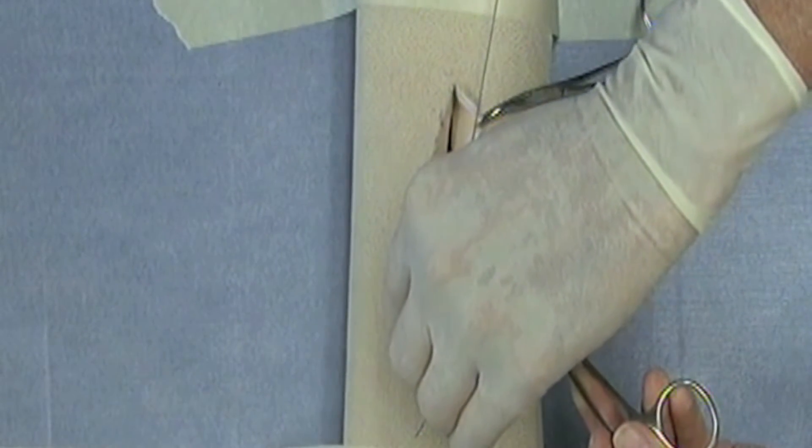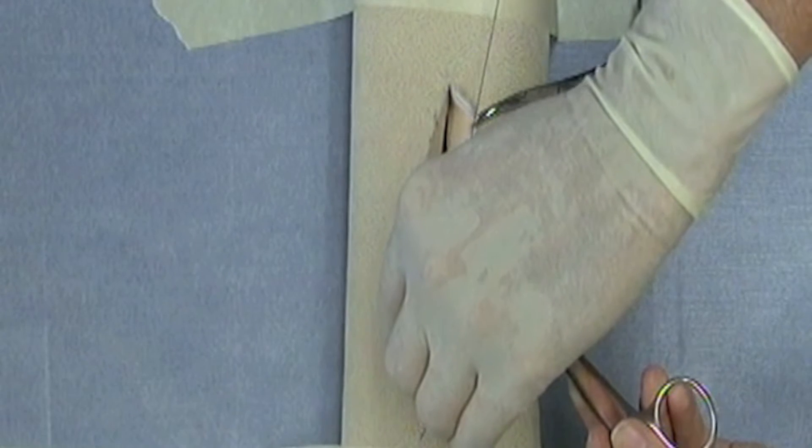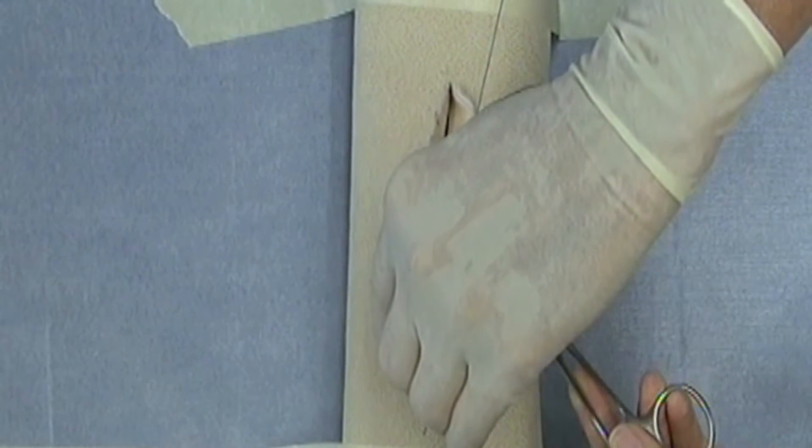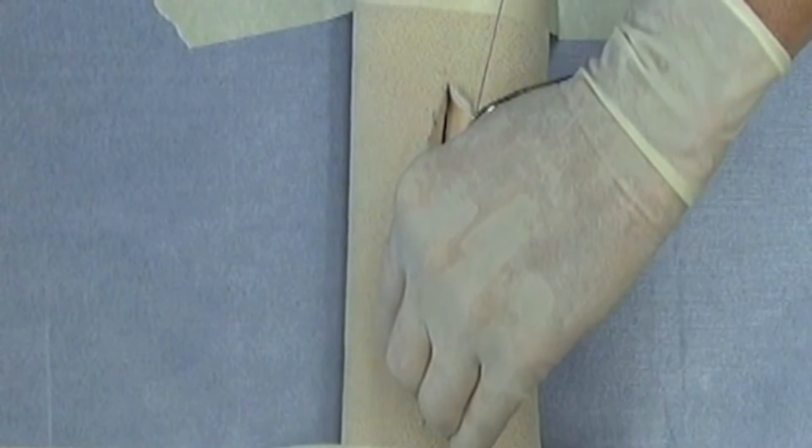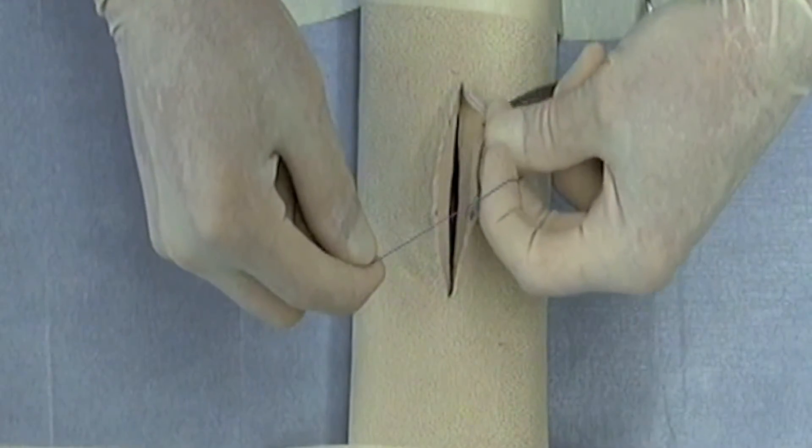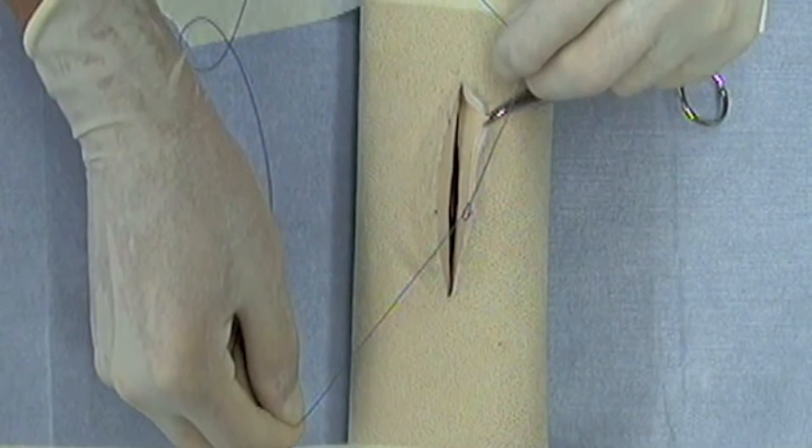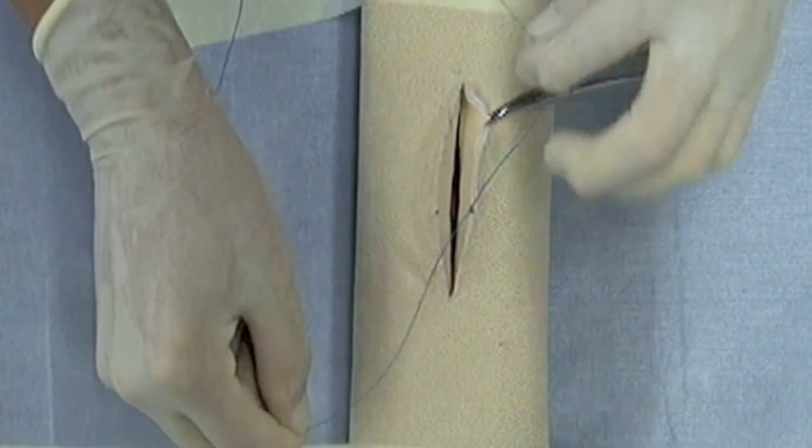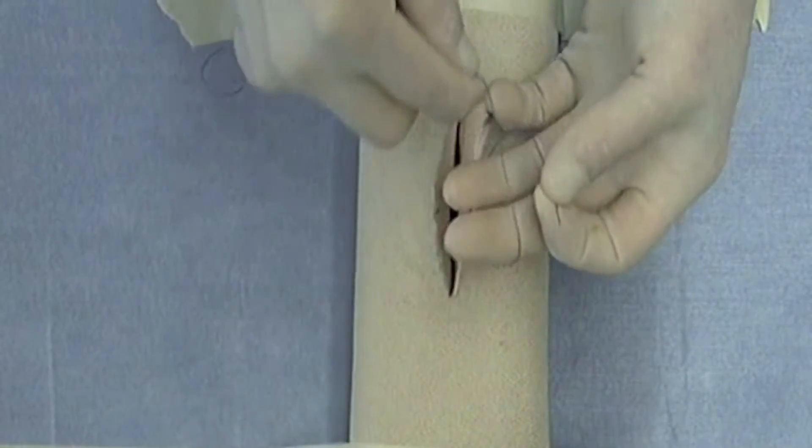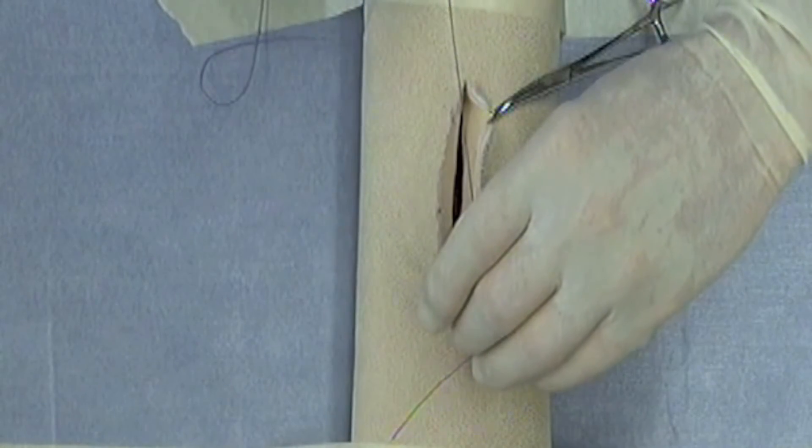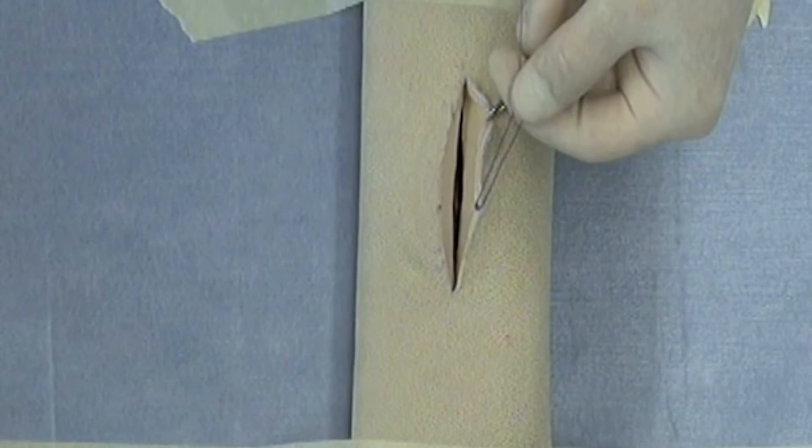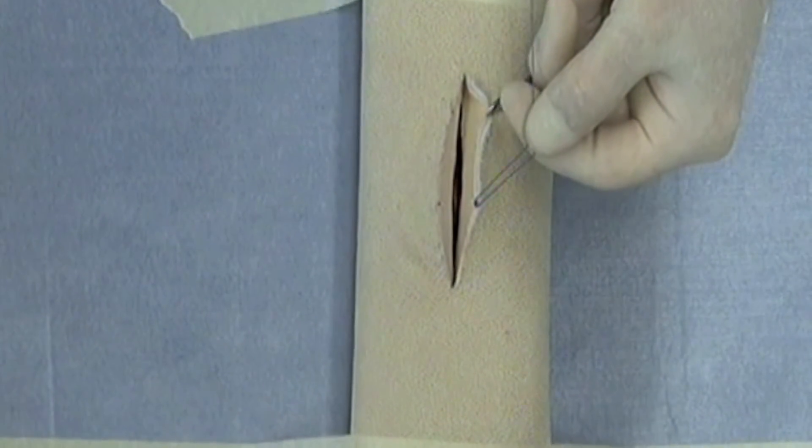Now at this point I'm going to have that pretty snug and I'm going to have the assistant, once I seat that into the tissue, the assistant now is going to release the clamp and now I completely snug down that suture and then I'm going to complete the second throw of a left-handed one-hand technique. Now I put an additional throw on top. So I have a square knot with one additional throw.